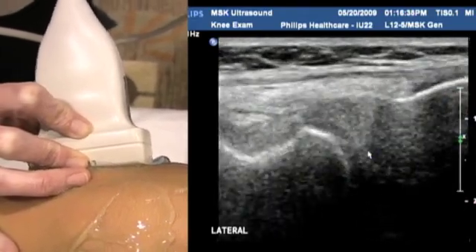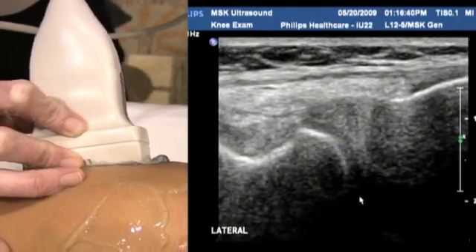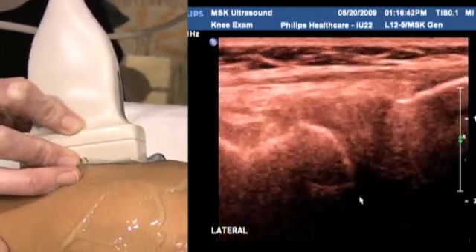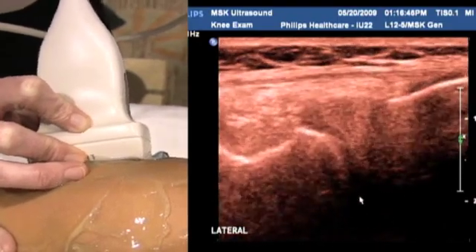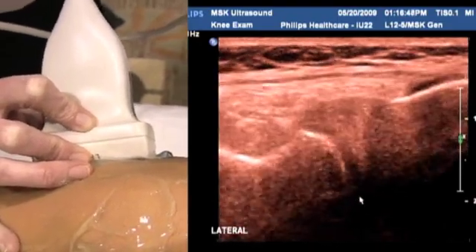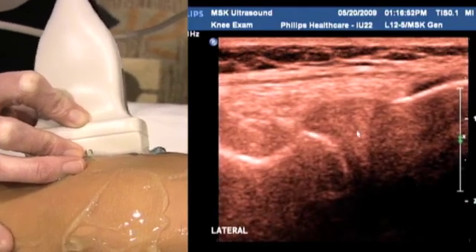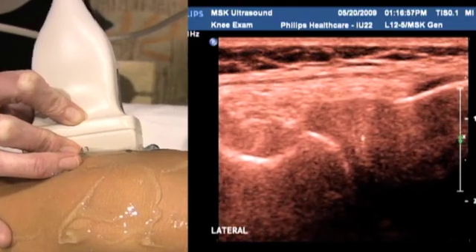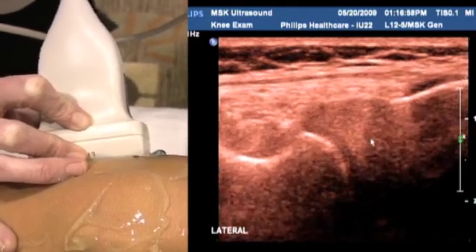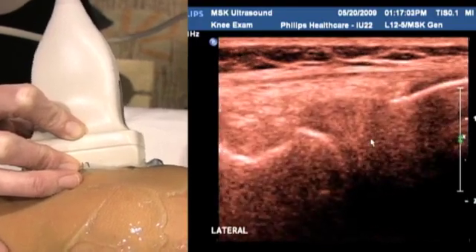The other trick you can use for looking at menisci in the knee is the chroma map. The eye is a little more sensitive to shades of colour than it is to shades of black and white, and so small little meniscal tears that come through here, which are going to appear as hypoechoic fissures in this echogenic structure. Sometimes they show up a lot clearer using the chroma, so that's just a little trick to keep in mind.